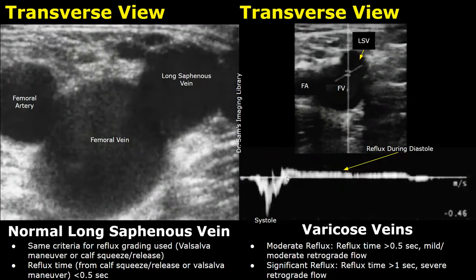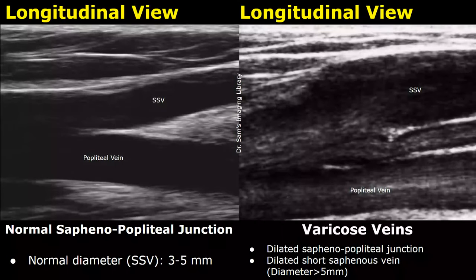In severe cases of varicose veins, you may also find reflux during diastole. There is a prolonged reflux seen in this case at the saphenofemoral junction. Here is an image of a normal saphenopopliteal junction. This is the short saphenous vein — the normal diameter of the short saphenous vein can be between 3 to 5 mm approximately.